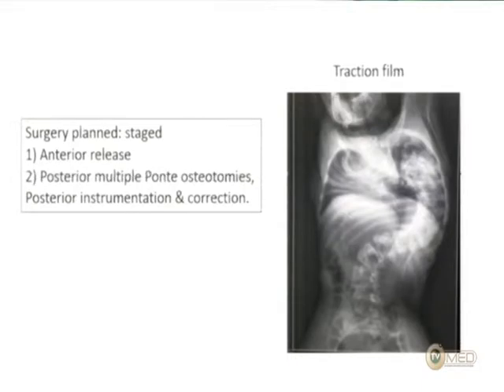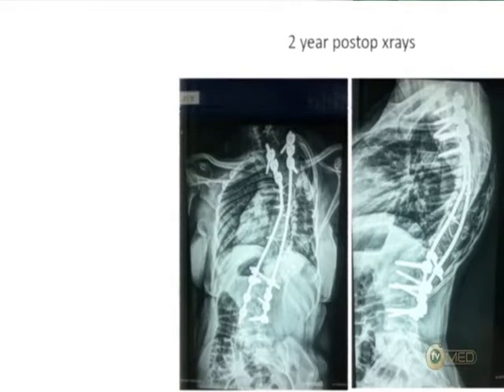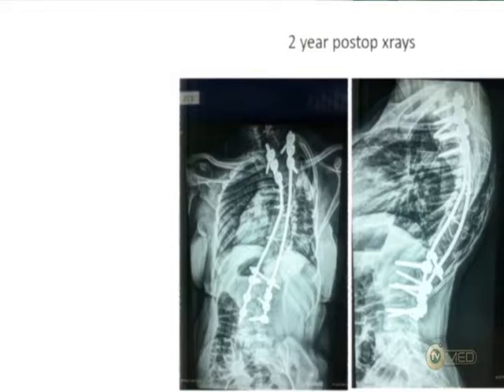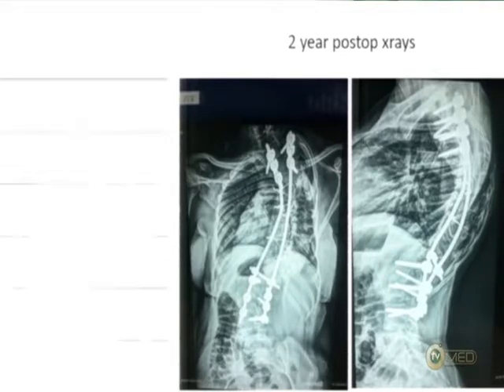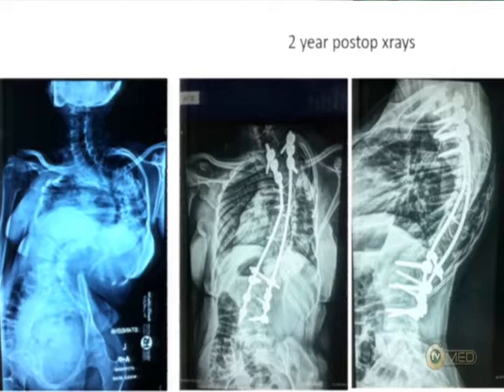Because the patient had previous anterior fusion, we performed multiple anterior osteotomies to undo the anterior fusion, followed by a posterior stage using sublaminar wires at the apex. The two-year post-operative X-ray shows significant improvement in overall balance and alignment. This young lady gained 11 centimeters of vertical height and continues to be a very happy woman — the pre-op to post-op comparison shows the magnitude of what was achieved.